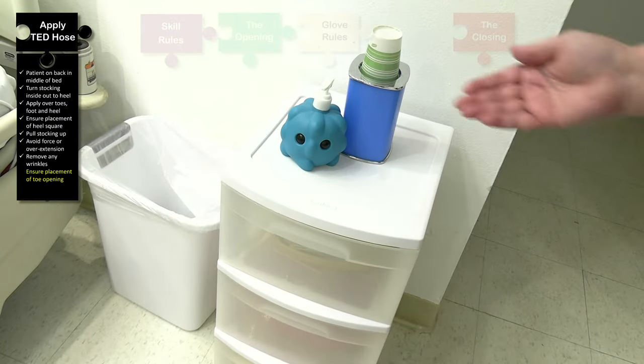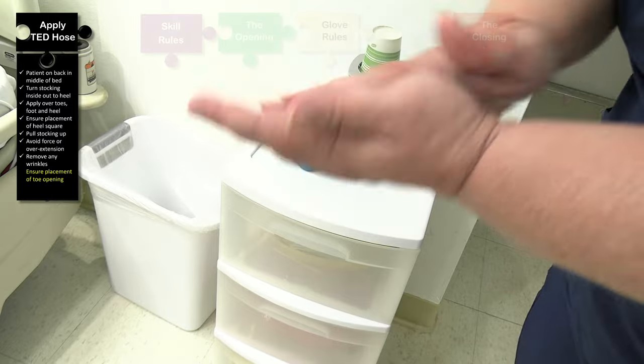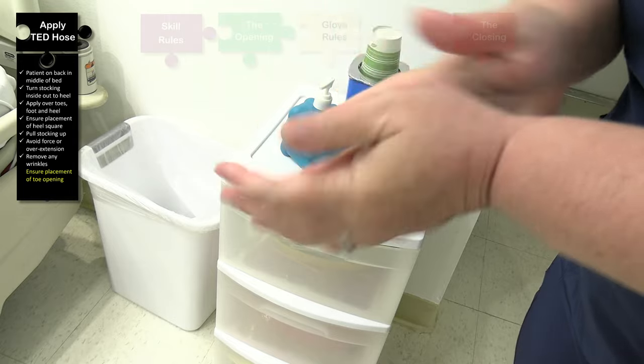We want to make sure that there are no wrinkles on the TED hose. We're going to remove any visible wrinkles by pulling upward and smoothing the sock along the leg. We want to make sure the heel is over the heel of the patient and that the toes are aligned with the top of the stocking. Once the stocking has been applied, we're going to sanitize our hands before touching any personal items.